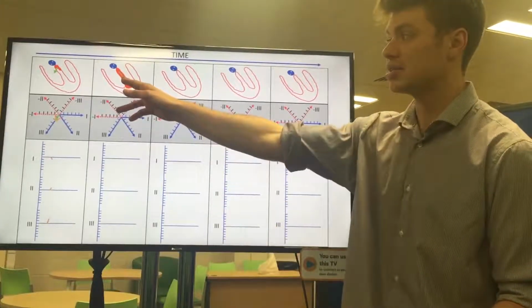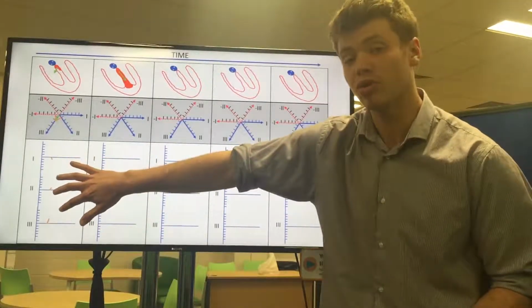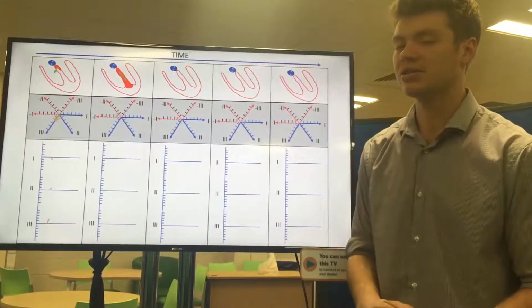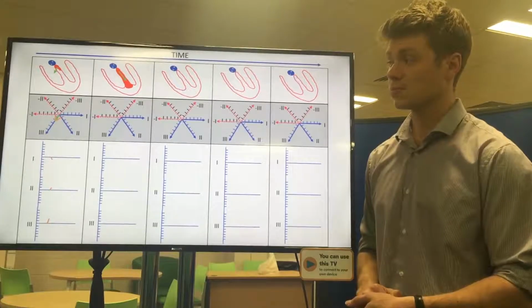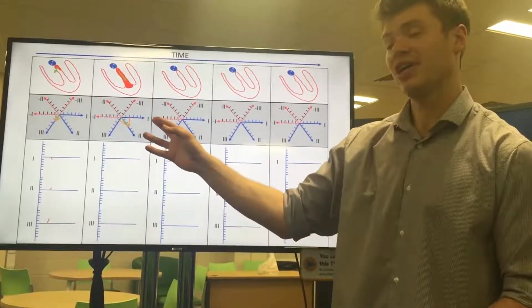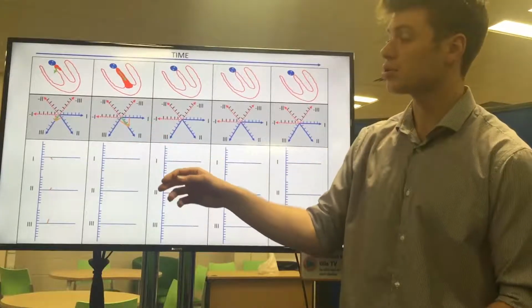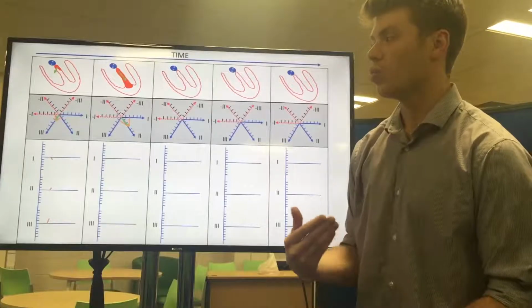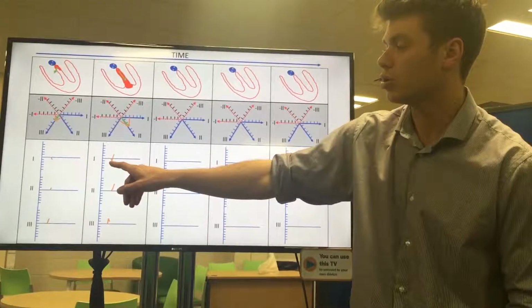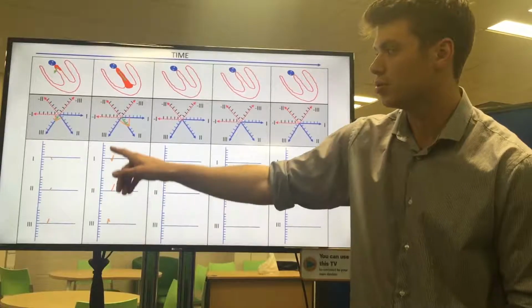So again, pause the video, copy and paste this vector into here, and then plot the values on here. Remembering to move everything from here across, because this has already been recorded by the ECG machine at this point. So we've already moved down on lead 1, and then let's see how far up it goes on lead 1 after this. So give it a go now. So this is the value that I got. So I moved this vector down. I saw that it went to the positive end of lead 1, and I measured that it went 2 units across. I saw it went to the positive end of lead 2, and it went 3 units across. And I saw that it went to the positive end of lead 3, 1 unit across. So I just moved everything from here across and then saw what happened. So it went from -1 all the way up to +2. It went from +1 to +3, and it went from +2 down to +1.